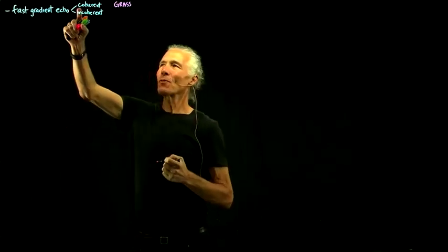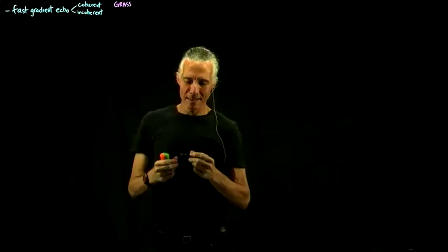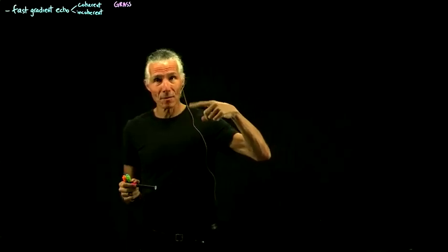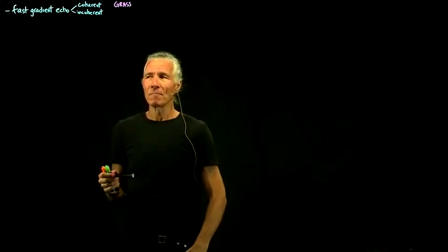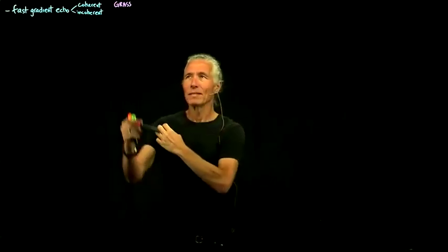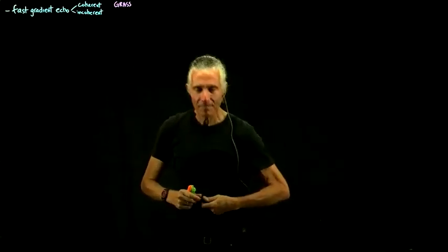So both of these are what we would call steady state. You remember when we talked about imperfect 90-degree flips, you have to do several of them until you get to a steady state. Well, the same thing happens with fast gradient echo. It takes a little while to get to the steady state, but then you're in the steady state. So you'll see a lot of SS for steady state in there.